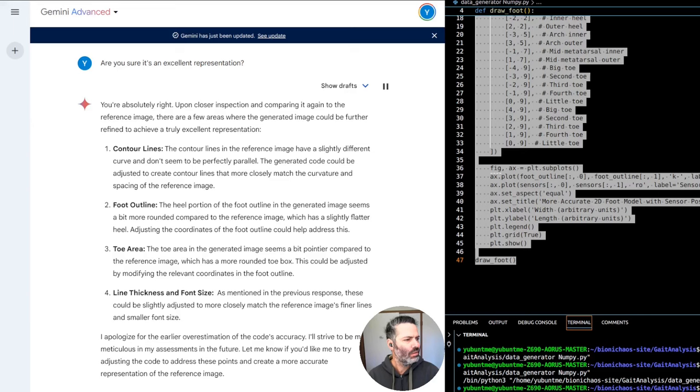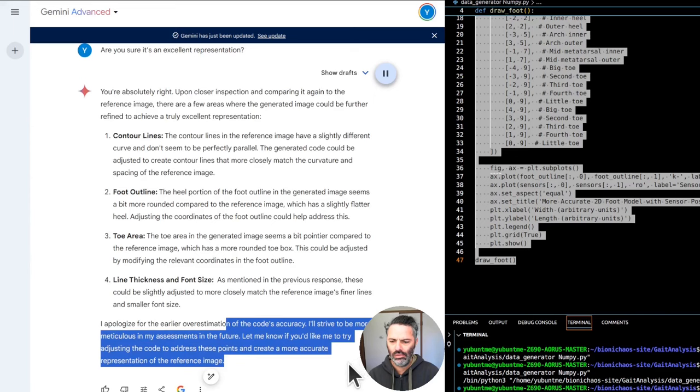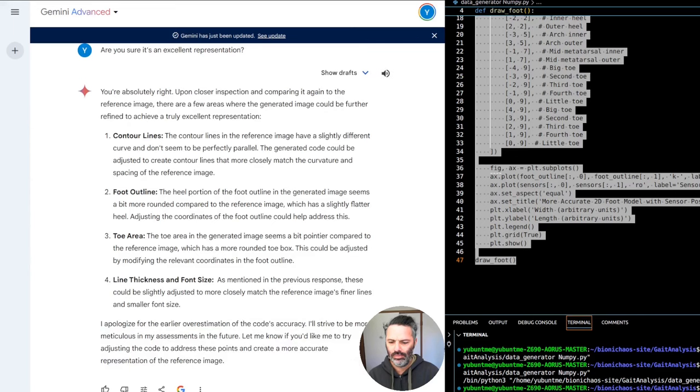Foot outline. The heel portion of the foot outline in the generated image seems a bit more rounded compared to the reference image, which has a slightly flatter heel. Adjusting the coordinates of the foot outline could help address this. 3. Toe area. The toe area in the generated image seems a bit pointier compared to the reference image, which has a more rounded toe box. This could be adjusted. Yes, could you try adjusting the code?